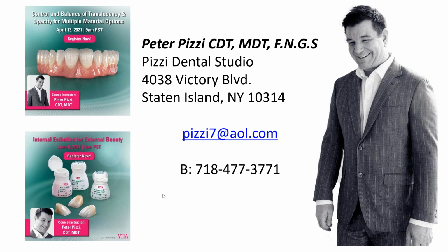The other thing that you could do too is with the ceramic system, and I probably should have showed this, I'm not sure why I didn't, but the actual shade tabs of the ceramics that you use are a really nice, useful tool. So your doctors may not have them. Maybe you want them to get them sometimes, but I can tell you if I'm struggling to look at what I see in the shade, I might take out the translucence of the VM9 kit or one of the actual guides of the kit and utilize that to help me see what the color is.